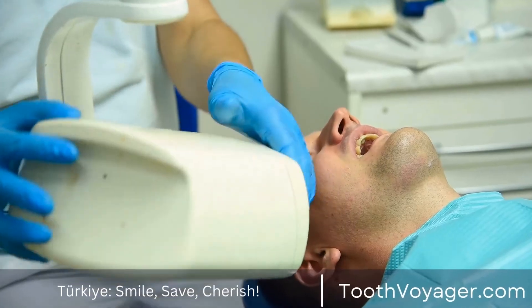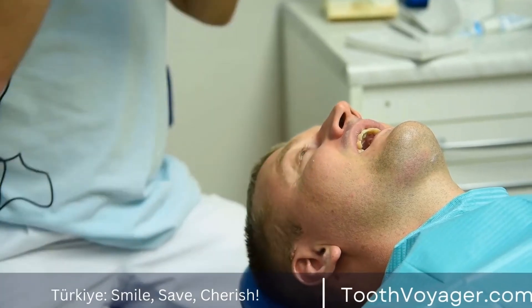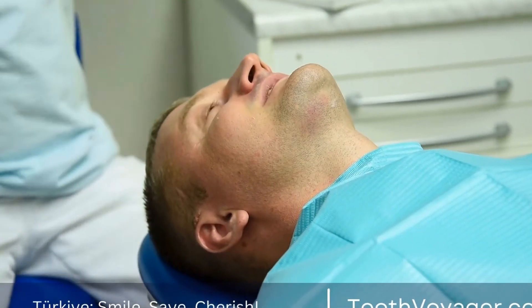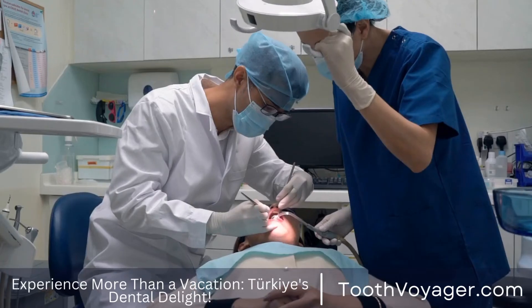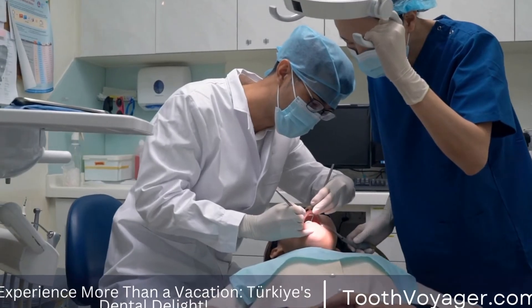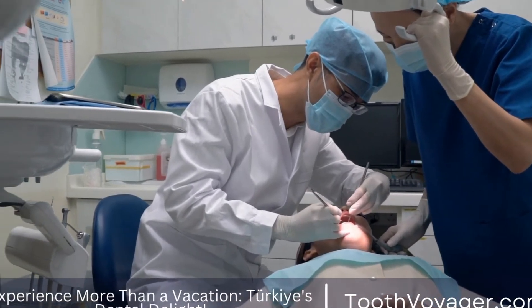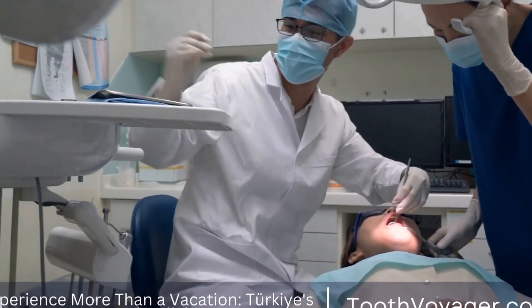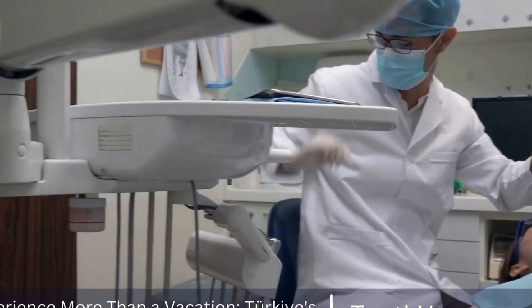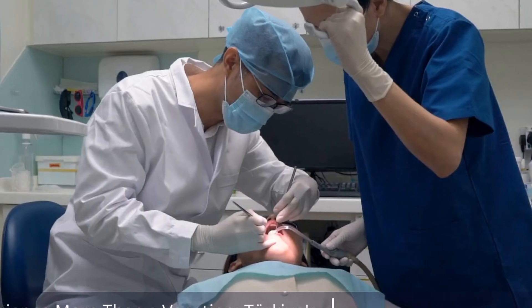Composite resin veneers, on the other hand, can be made in the dental office. The dentist will apply the composite resin material directly to your teeth and sculpt it to the desired shape before hardening it with a special light.